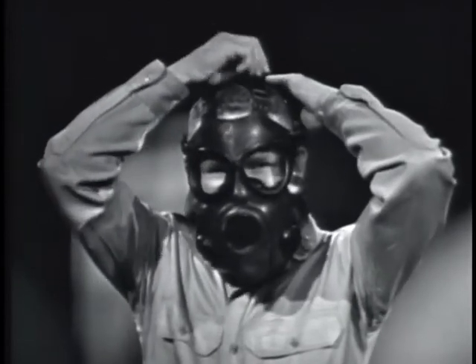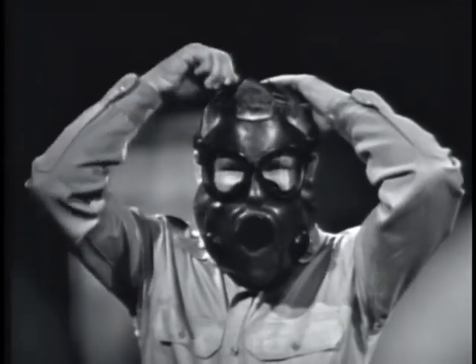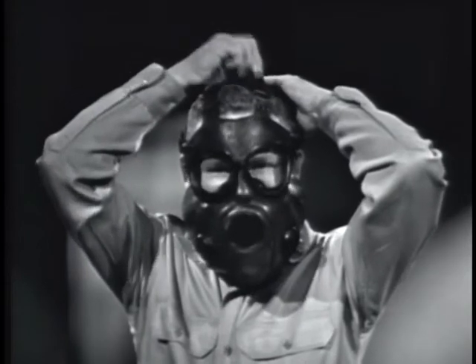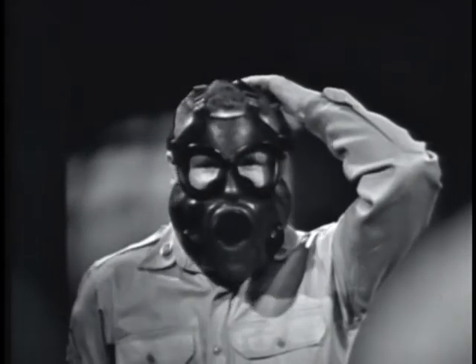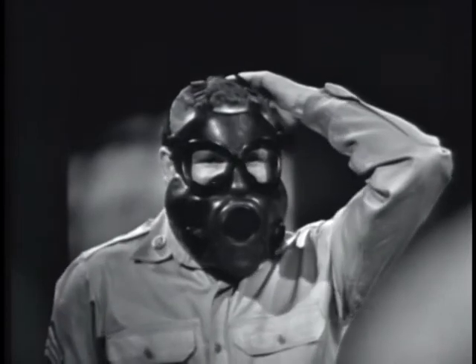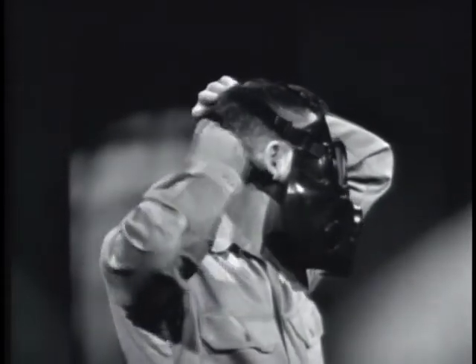Tighten just enough to remove the slack. Adjust the straps by rapid jerks rather than a steady pull. Adjust each cheek strap until both are moderately and evenly tightened.